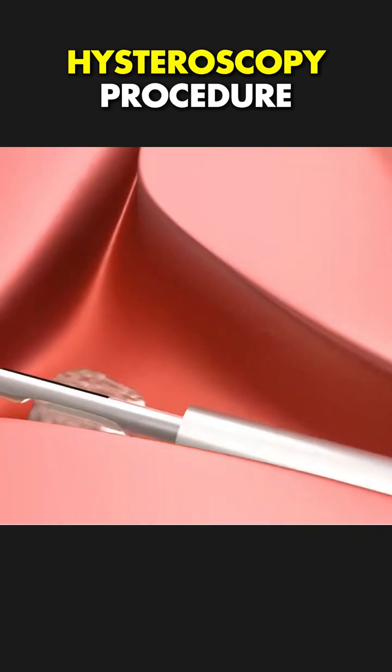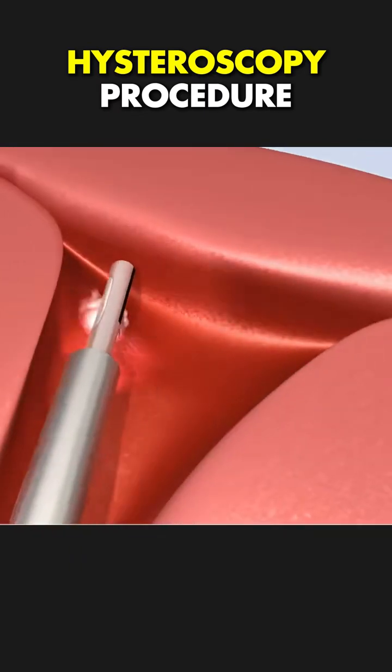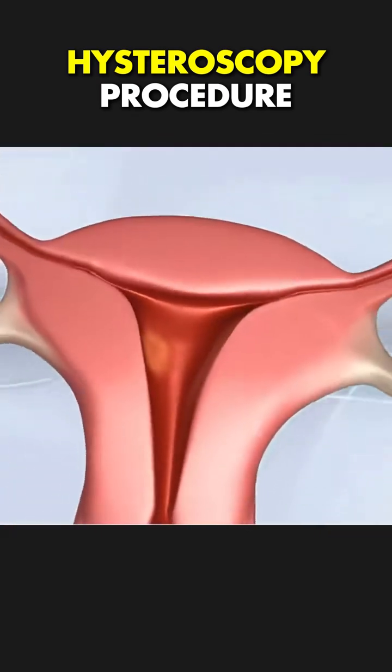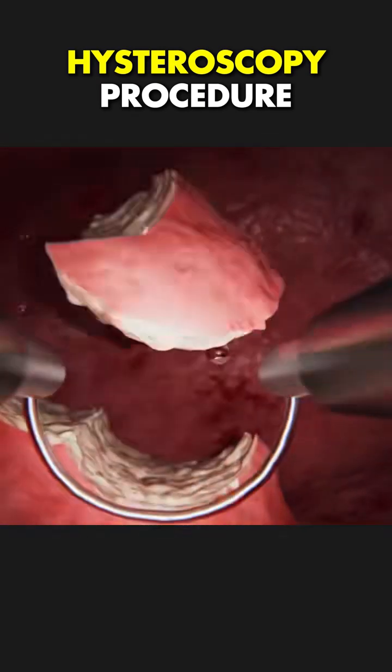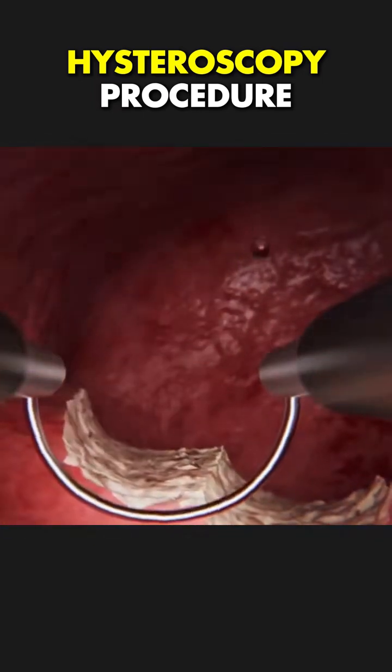Once done, the hysteroscope is taken out, and the patient can usually go home the same day. This minimally invasive procedure helps relieve heavy bleeding, pain, and fertility issues.